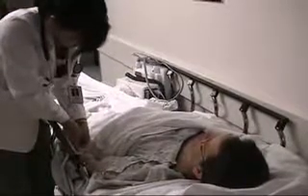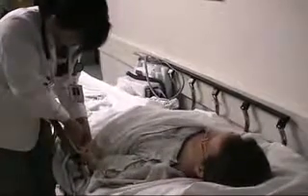Here you see TPA being administered in the hallway between the CT scanner and the MRI scanner. Typically it is administered as soon as possible, often in the CT scanner, but this can also occur either in the hallway or in MRI in the presence of a nurse and while the patient is connected to a monitor.